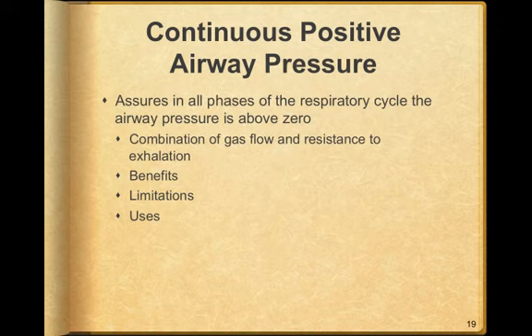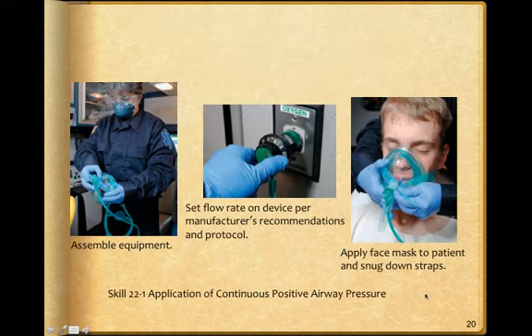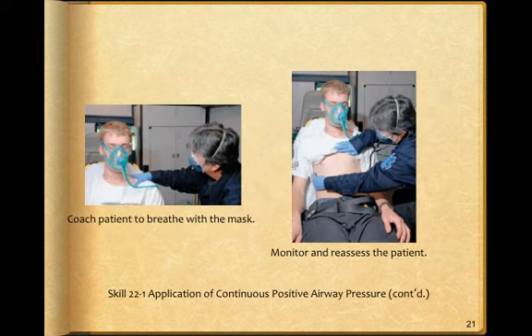And this is skill 22.1 in your book. Essentially assemble the equipment, and this would depend on which CPAP unit you actually had. Set the flow rate on the device per the manufacturer's recommendation or the protocol, and then apply the face mask to the patient and snug down the straps. Coach the patient to breathe with the mask and monitor and reassess the patient.